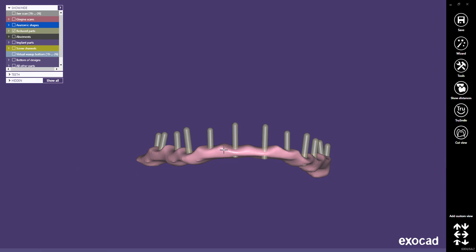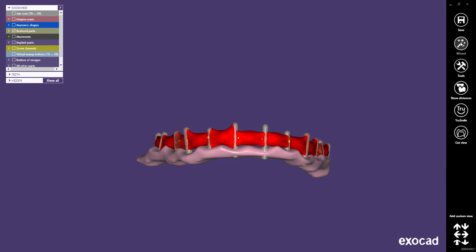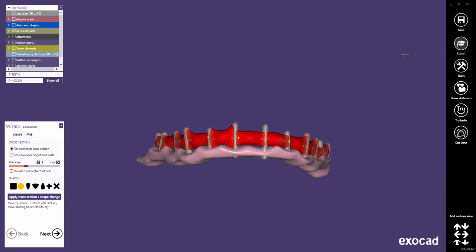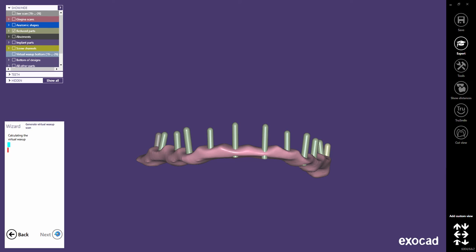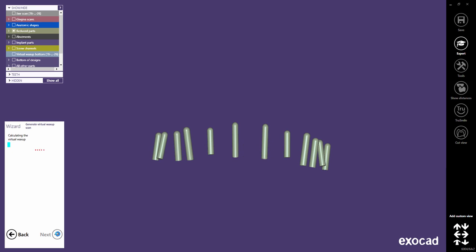Restart the wizard to continue the design process. Starting with ExoCAD version 2016, you can delete all connectors with a click in the Connectors dialog. Click Next to merge all meshes into a virtual wax-up.